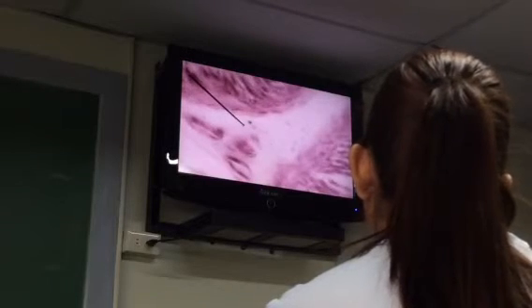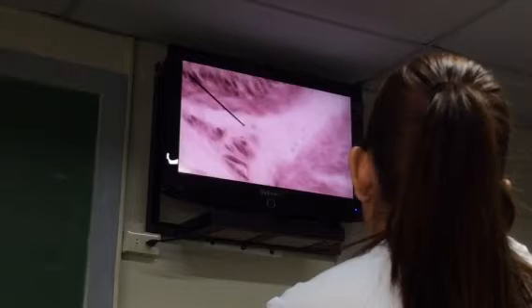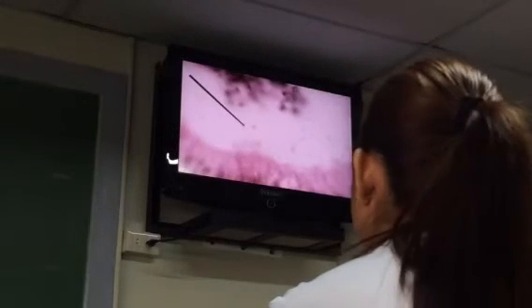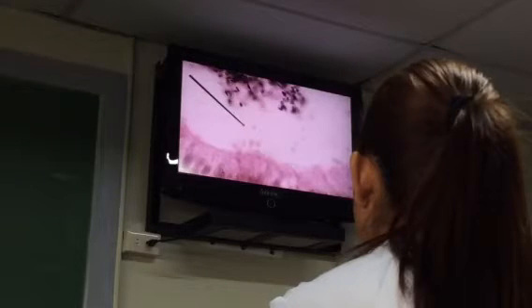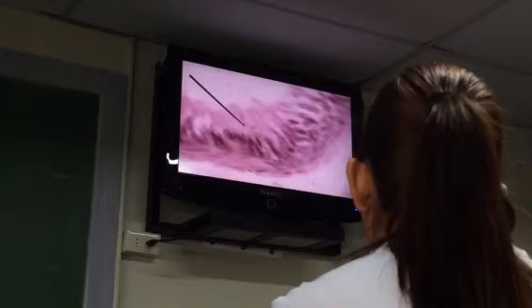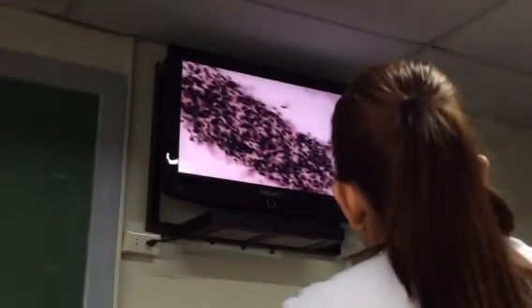Now, this is the only organ with stereocilia except for the vas deferens. The vas deferens, though, has only some stereocilia. Ito puro with stereocilia. Okay? Another clue that this is epididymis, there you go, look at the lining, is that within the lumen of the tubule are sperm cells. Bakit po may spermatozoa dito, ma'am?